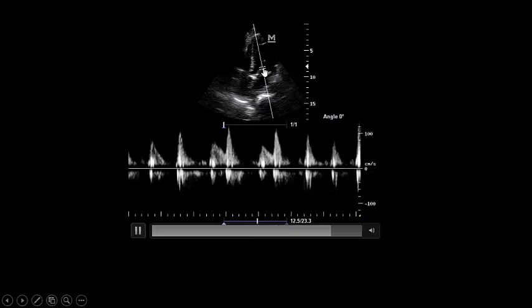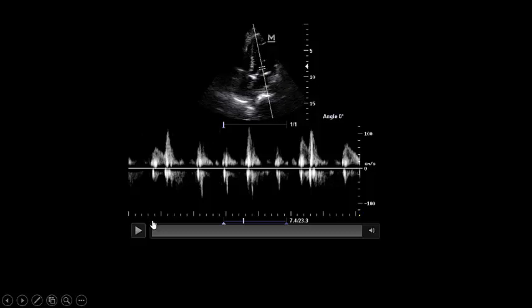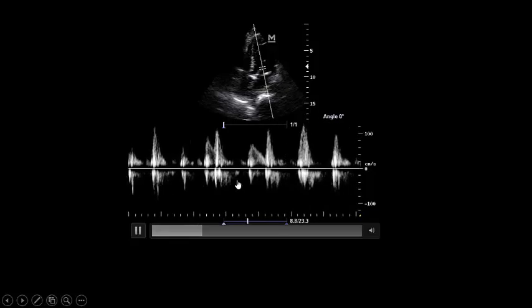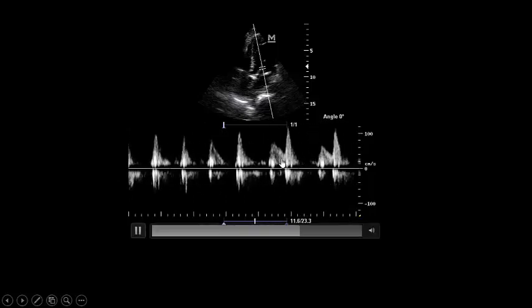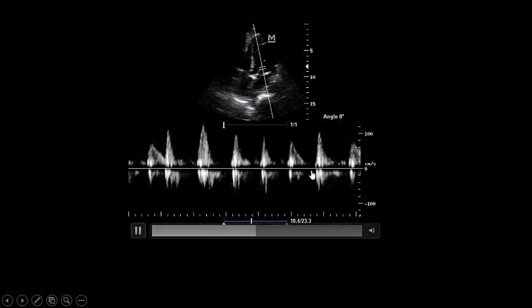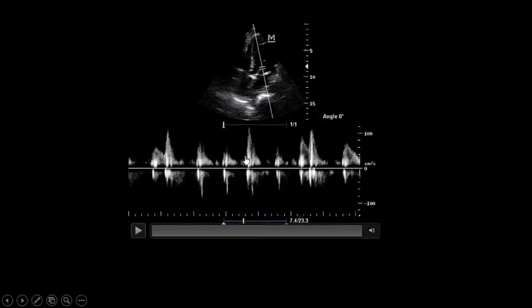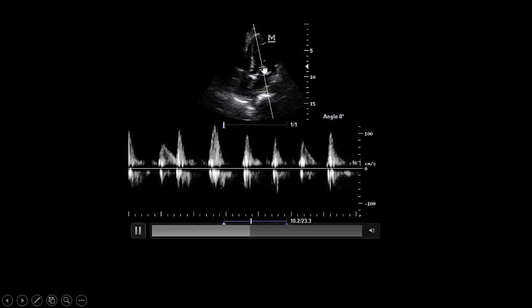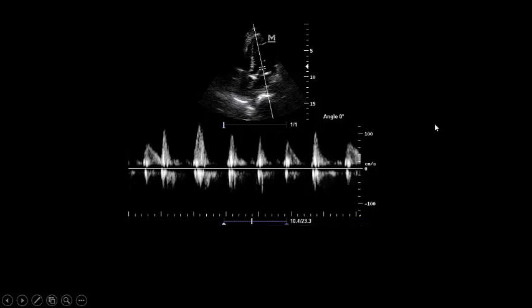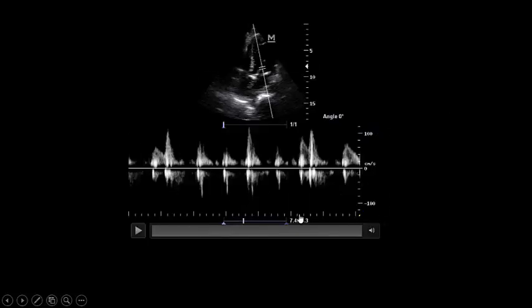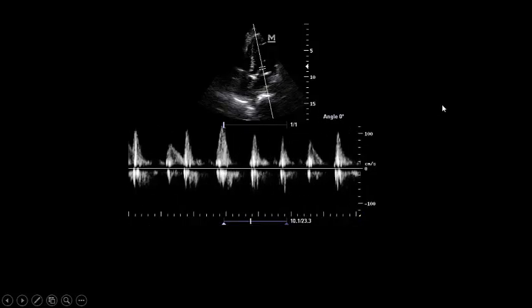I placed pulsed wave Doppler at the tip of the mitral valve and obtained the mitral flow. You can see sinus beats with E and A waves, but there is a lot of arrhythmia here with loss of the A wave. The E wave represents early diastolic filling of the left ventricle, and A represents the atrial kick. There are periods of atrial arrhythmia without an atrial kick — only the E wave flows. Very clear arrhythmia is present in this patient.